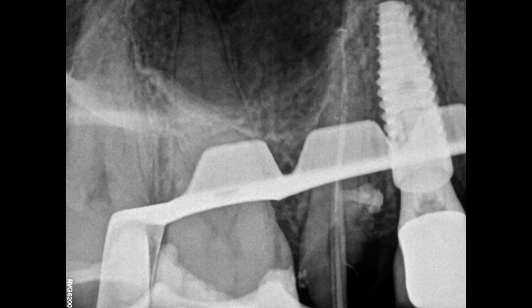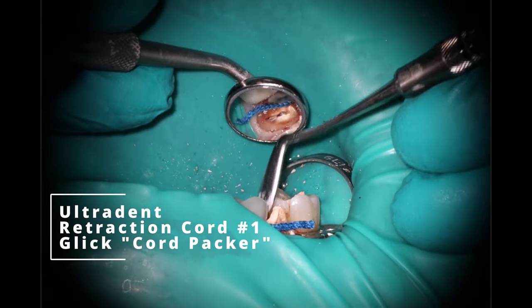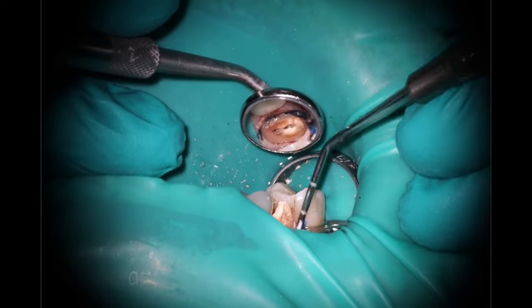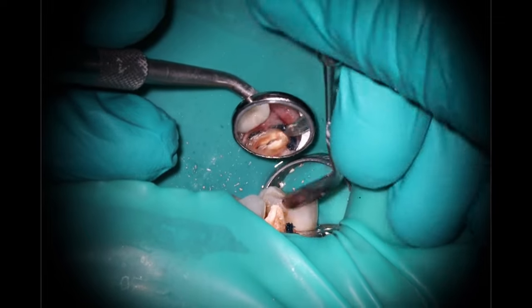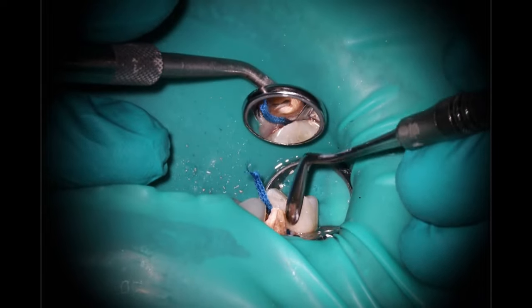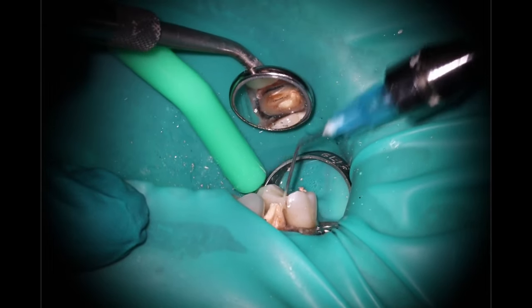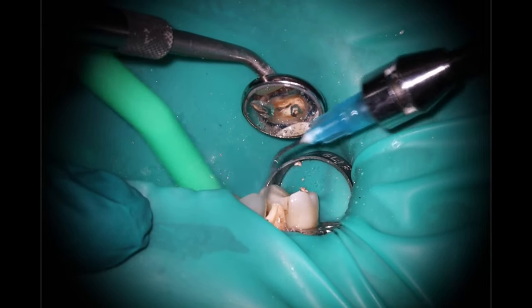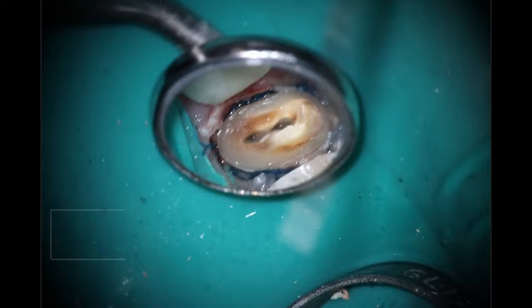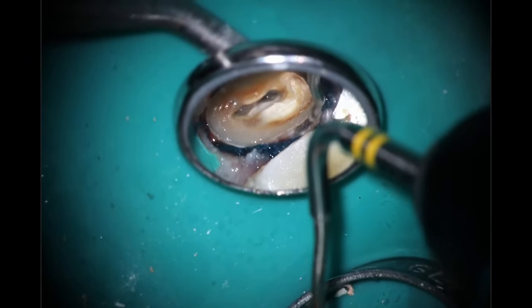I decided to use cord here — yes, I am an endodontist who has cord, not the most common thing. I don't have a cord packer, so I just kind of use my Glick. The reason I place cord here is because it's circumferential — I want to push the gingiva out of the way rather than remove it. It is nice, healthy gum tissue at this point. There will be some bleeding at the end from having the cord in there and from a little prep right along the margin. By keeping the gum tissue out of the way, I think this works better than trying to remove all of it.